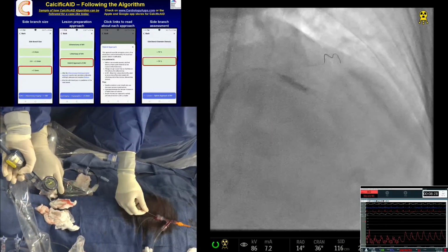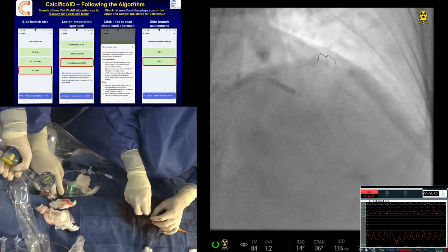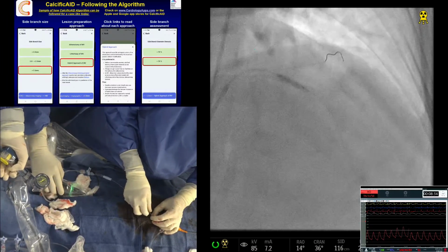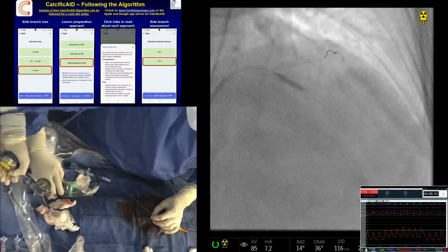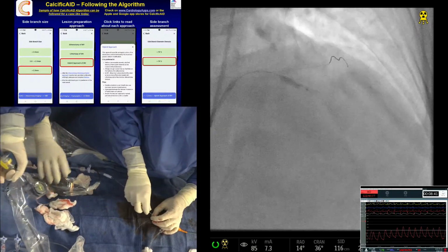No, for the diag we can have just a high pressure balloon, 3 or 12. Okay, down. Get us a high pressure balloon. No, no, we had, right? No, we do not have a high pressure balloon, but we have 20. Okay, 6. Down. Yeah, and down.